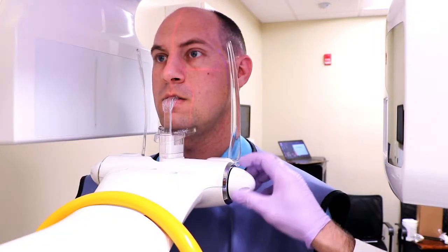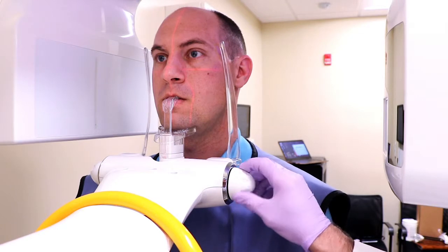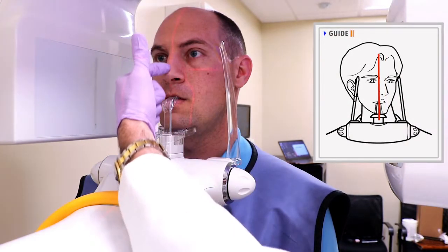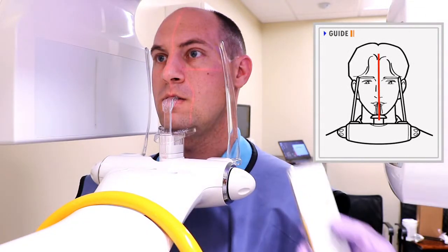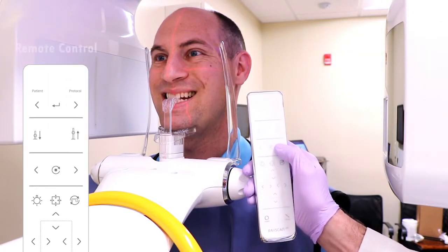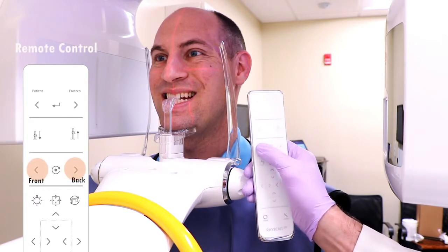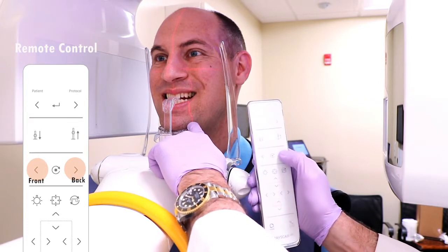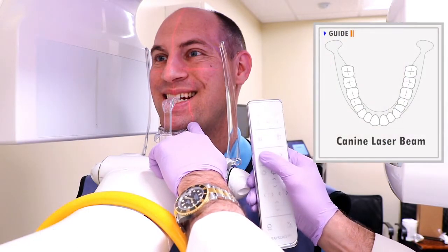Tighten the temple supports using the white knobs, and make sure that the vertical laser beam is positioned at the center of the patient's face. Adjust the canine laser beam using the remote control or touch screen on the rescan. Align the laser beam centrally on the canine.